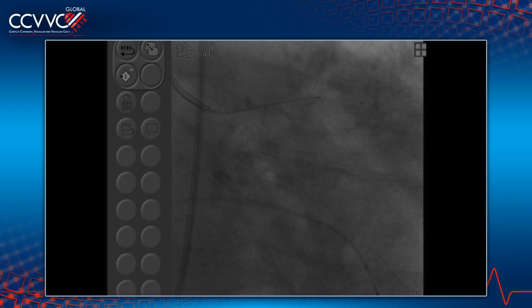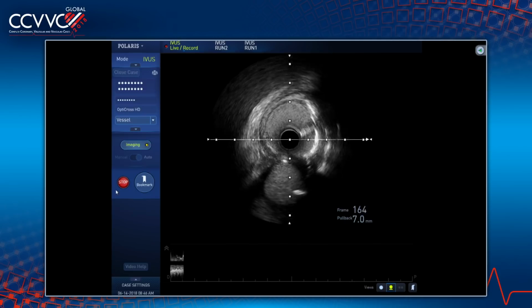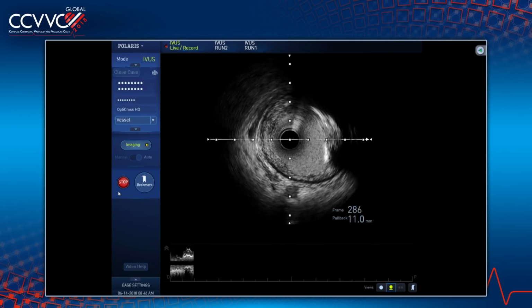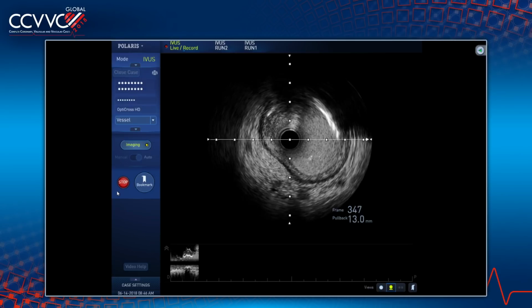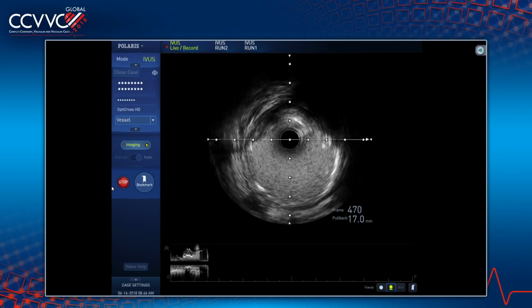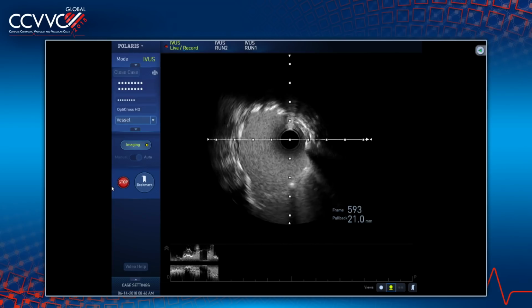Yeah, these are really important. Can we show the IVUS? At the end of the day, I think about the left main. That's what I said to Chet just now. There's marginal financial benefit on TAVR only if you get your patient out in the first 5 days. If it's longer than that, or if you do something like this on top of it, you've just evaporated that margin. Look at this.